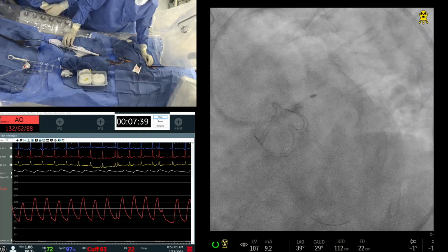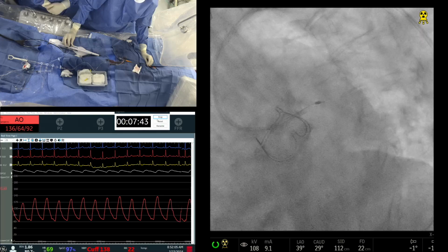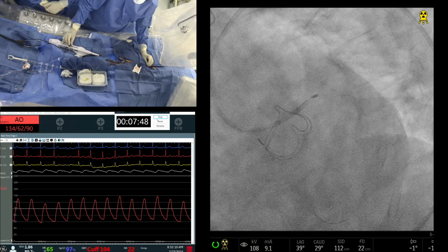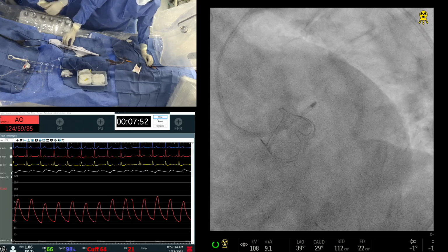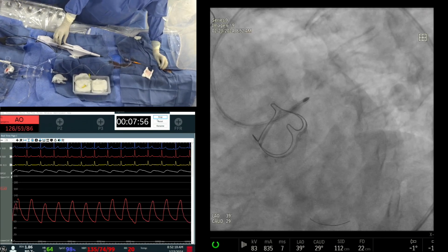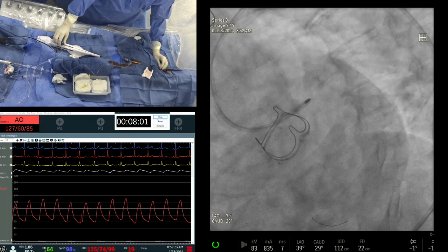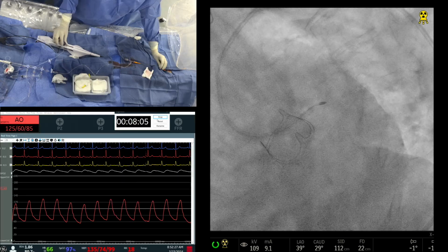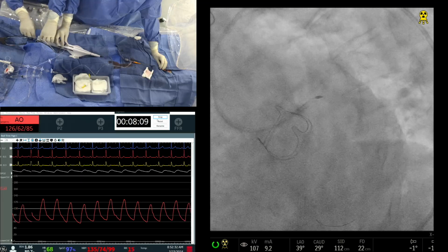Dr. Sharma sir, Subhash Chandra here. Yes, Subhash. What's your plan? Are you planning to have an elective 2 stent here? And if so, which strategy? Because this angle looks pretty good for even a TAP. Yeah. So what's your plan? So very good point. So the question comes, believe me, if not for the thrombocytopenia, there was no question in our mind, we would put 2 stents. Because of thrombocytopenia, you always are concerned, although the patient had tolerated clopidogrel and the platelet count remains 75.